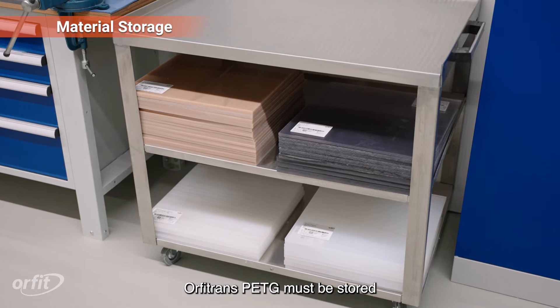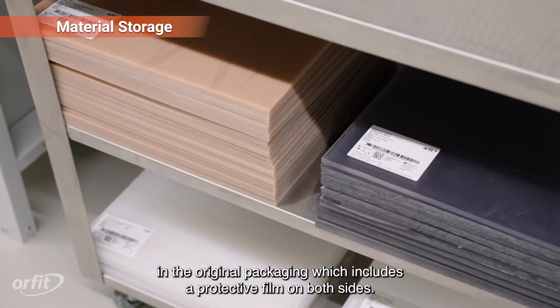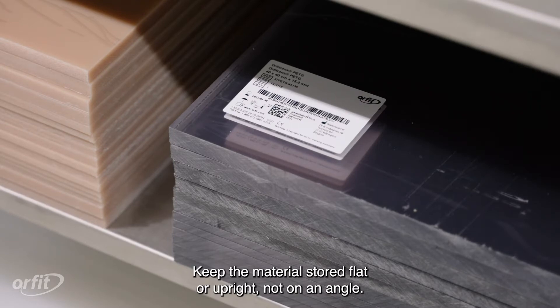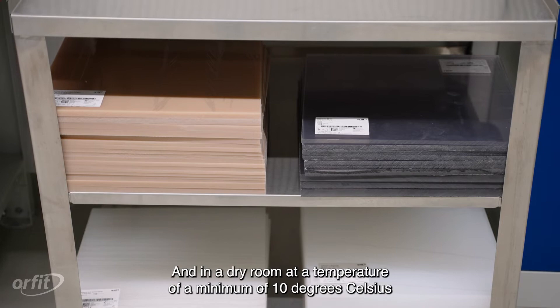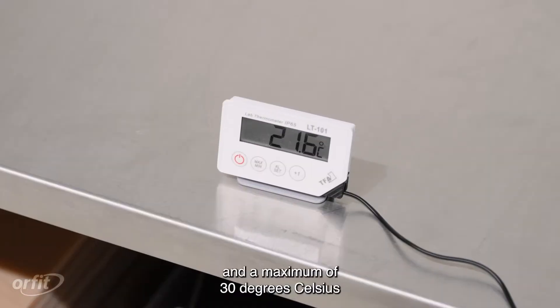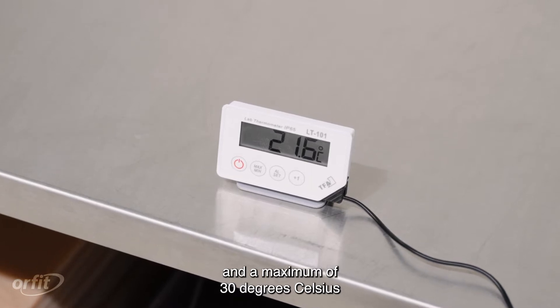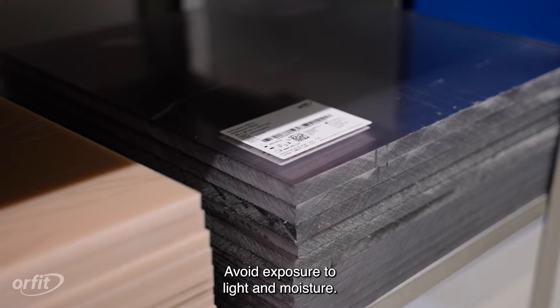Orphatrans PETG must be stored in the original packaging, which includes a protective film on both sides. Keep the material stored flat or upright, not on an angle, in a dry room at a temperature of a minimum of 10 degrees Celsius (50 degrees Fahrenheit) and a maximum of 30 degrees Celsius (86 degrees Fahrenheit). Avoid exposure to light and moisture.